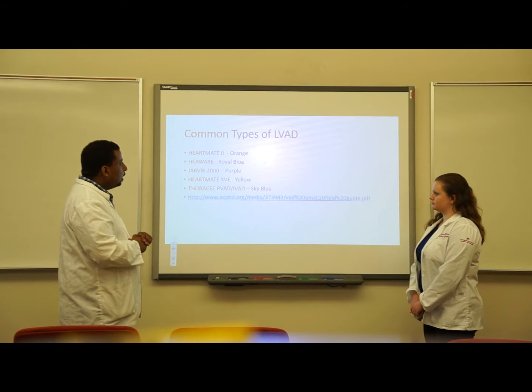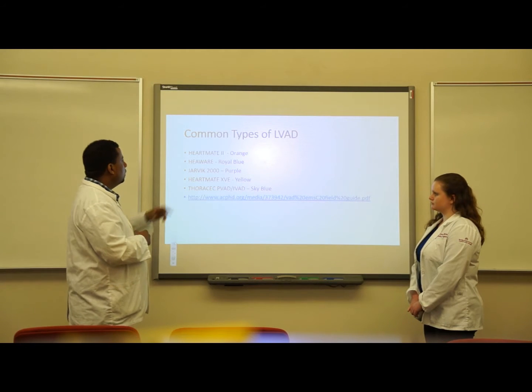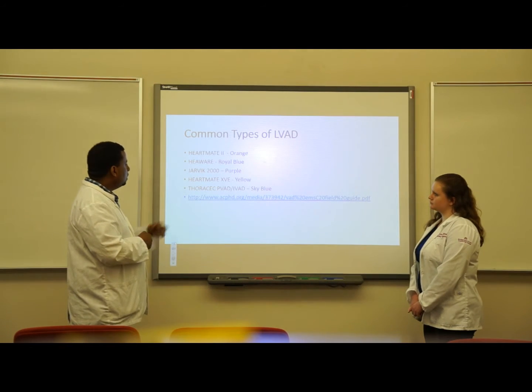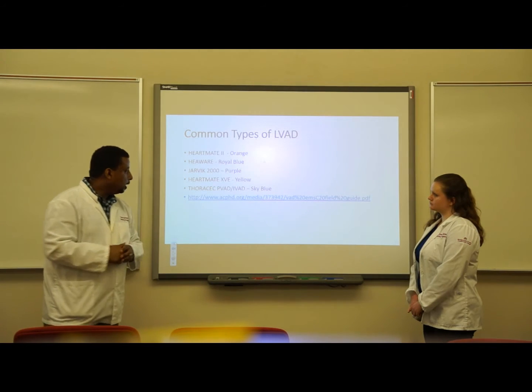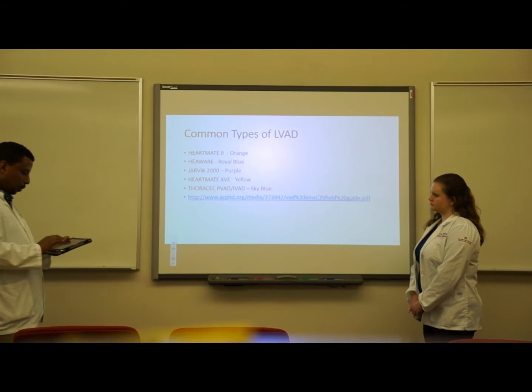And then I'd like you to be familiar with the various types of LVAD systems. So we have the HeartMate, the HeartWare, the Jarvik 2000, the HeartMate XVE, and the Thoratec. And knowing this is very important.